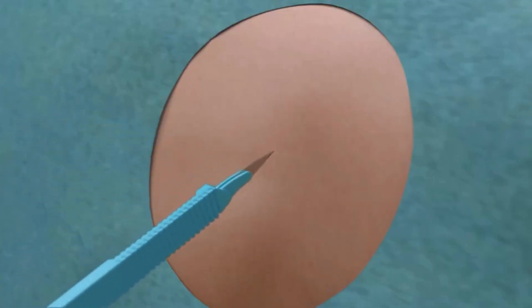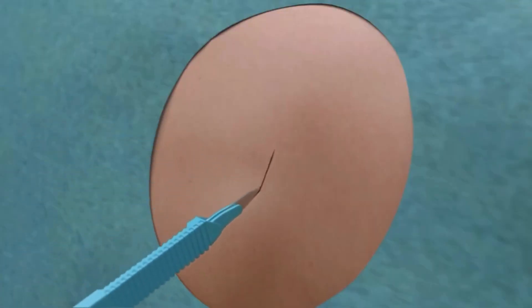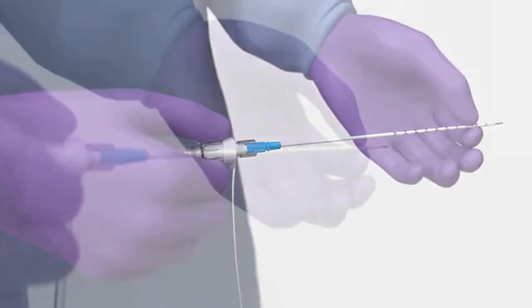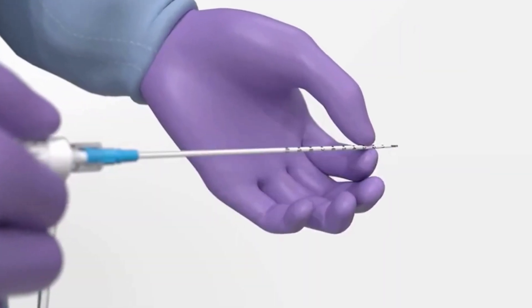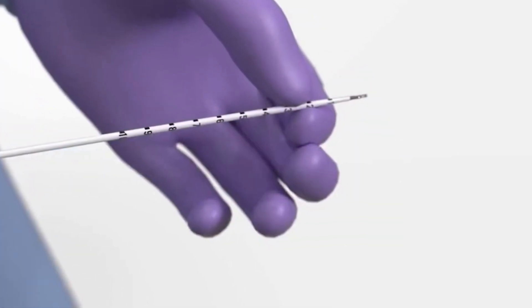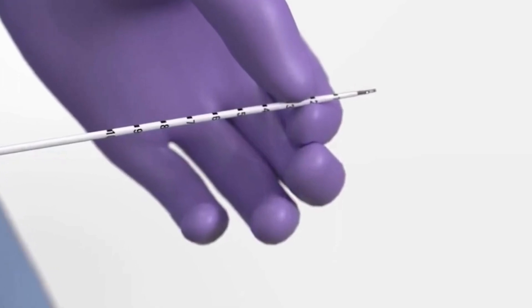Use a scalpel to make a skin nick prior to inserting the Safety Centesis device. To avoid inadvertent catheter movement or uncoupling of the assembled device, grip the introducer needle assembly firmly in a pistol grip while supporting the tip of the catheter at the site of insertion with the other hand.